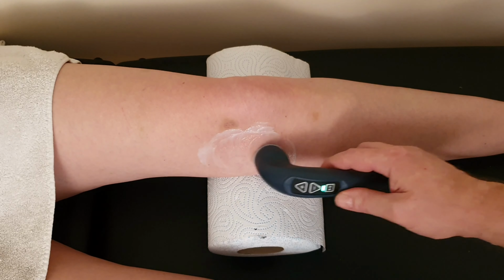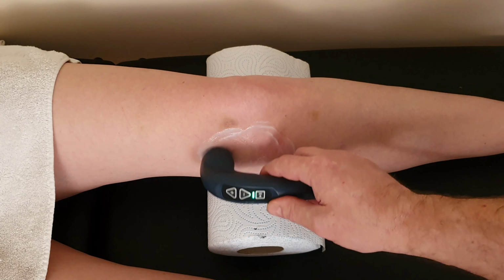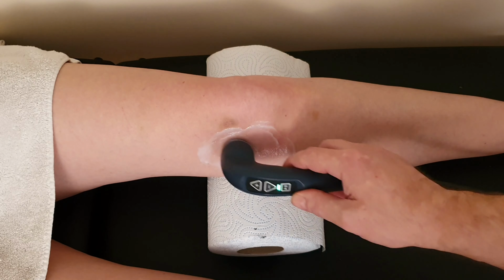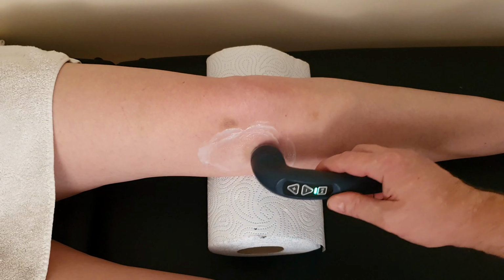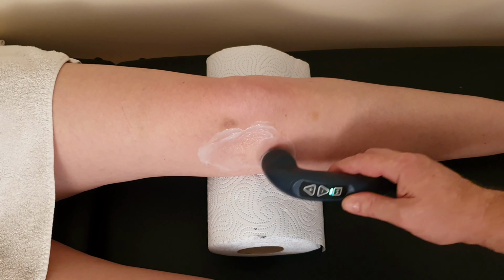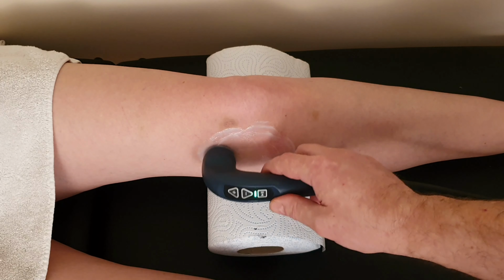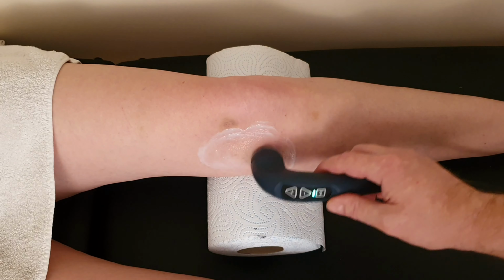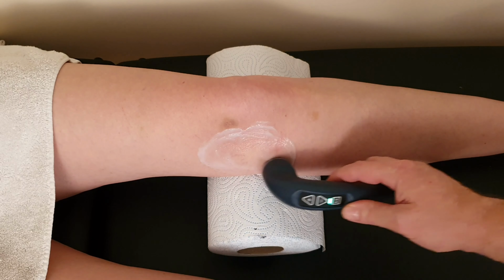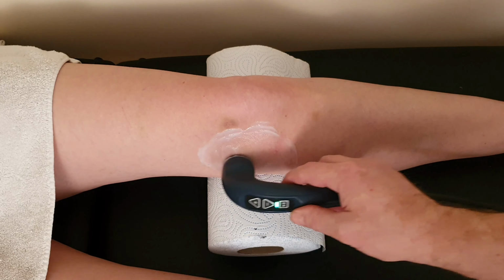So if you're over the down button, you can just press it down, but make sure you keep the head moving. If you stop the head moving, the heat will generate very quickly. You can press the start stop button, so pause the treatment and then turn the treatment down, or you can take the treatment head off and turn it down, whichever you prefer, but you're probably going to end up turning this treatment down at some point during the session, especially if you're up in the 5 minute mark.